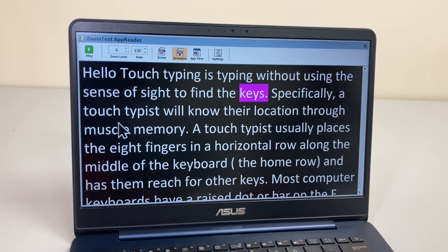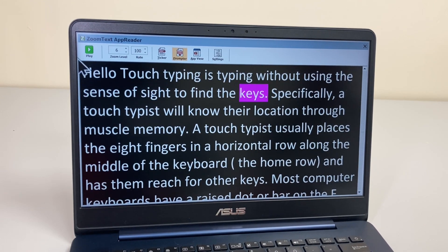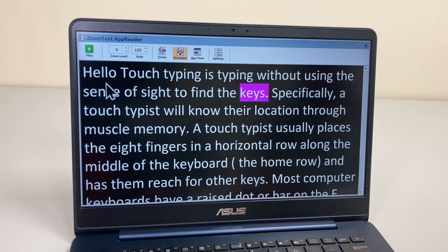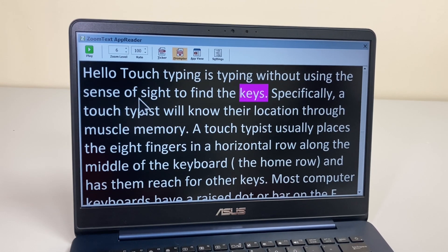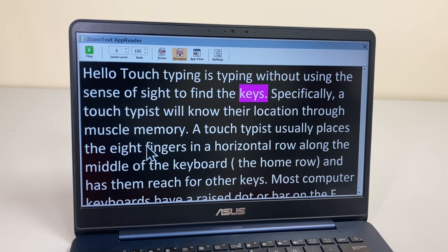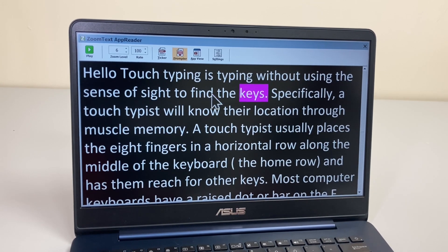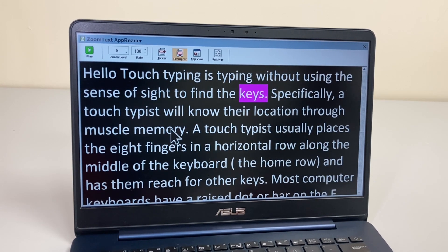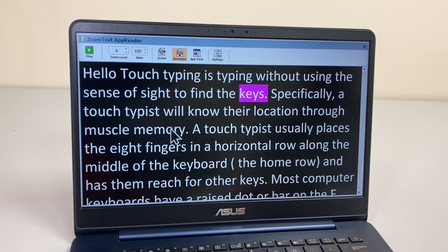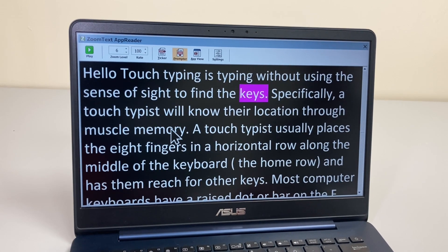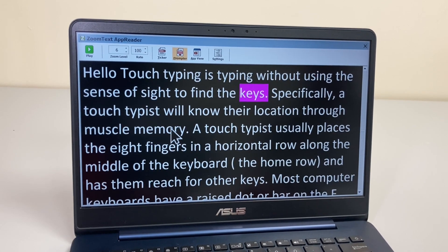To quickly show you the Text View as well — if I do my shortcut, it reads: 'Touch typing is typing without using the sense of sight to find the key.' I can pause and play at the top. It basically puts everything in one long column, so if that's easier to read, you can change all the colors as you'd expect. It takes a lot of strain out of reading long documents like this.